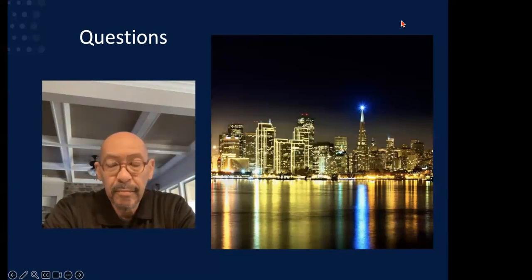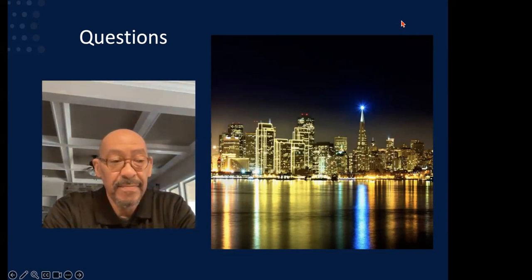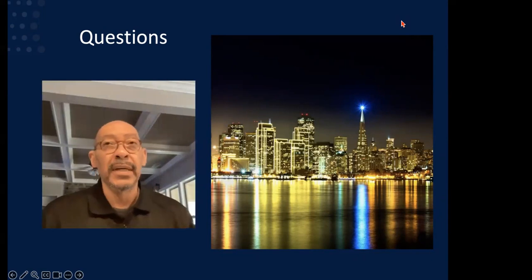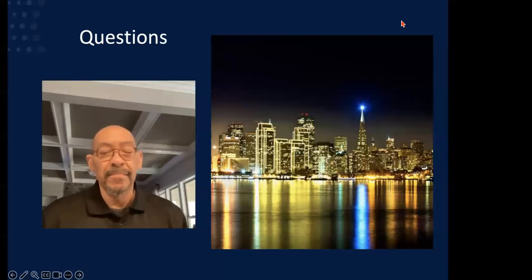There was a follow-up question, and I think this is a great question. Is it not a problem for the study participants if two different lens types are used? For the study, we will use two different lens types. For the targeted eye, we will use the Ocumetics accommodative lens, and for the non-targeted eye, we will use a controlled lens. That controlled lens will be something from another company. We aren't going to say which company. No, absolutely not. We can't do that.